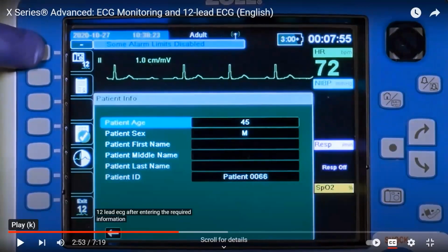So I was making notes to talk later, but two people in here decided to chime in. Sorry. The Zolls are not programmed to request that information, so on the side, make sure you hit the little clipboard below the 12-lead picture and put the current patient information in. Do you also want to talk about how it can be in adult mode? Yes, because adult mode is the only way you're going to access the 12 leads. When you turn on your machine, make sure you click the little button to go up to adult to be able to access a 12 lead, because ours default to pediatric.